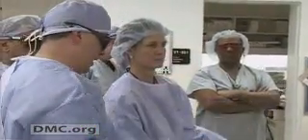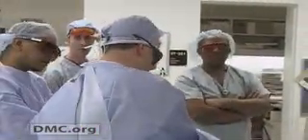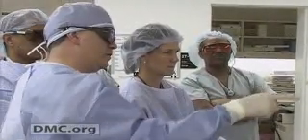Beneficial indeed. The original TURP procedure, which incredibly is still being performed in some medical centers, was effective, but had its drawbacks. The patient would be put to sleep or get spinal anesthesia, and a rather large metal telescope would be placed into the penis, and that's the way that you would get to the prostate and be able to look at the prostate. Then an electrified loop was used to shave out the blocking part of the prostate.